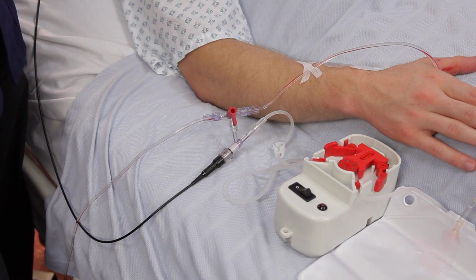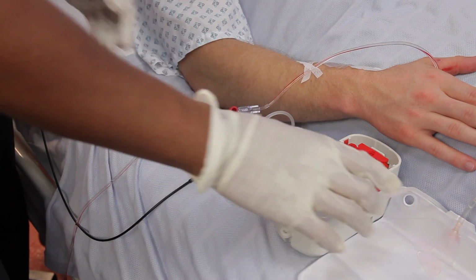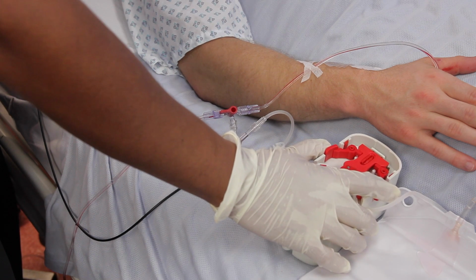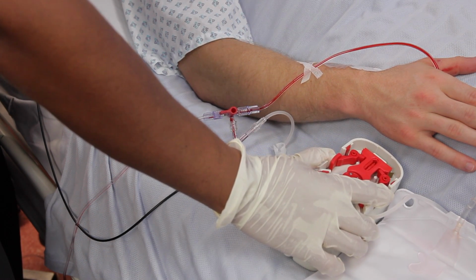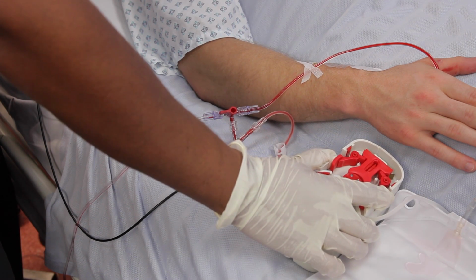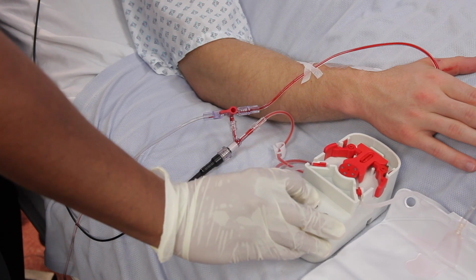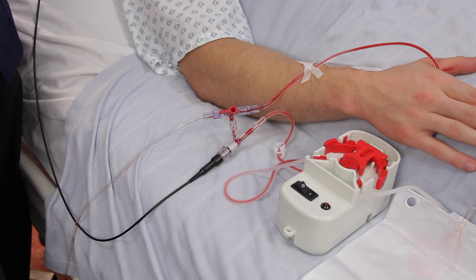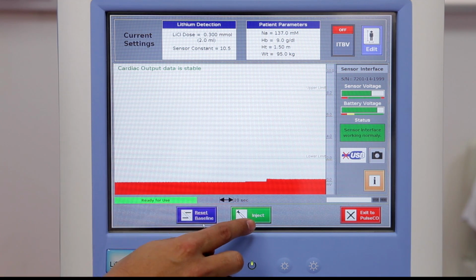Moving to the arterial setup, turn the three-way tap to open the LiDCO sensor to the patient. Squeeze the tension levers on the flow regulator to allow blood to flow over the sensor. When blood has passed the sensor, release the tension levers and switch on the flow regulator pump. Once this screen states ready for use, press inject.